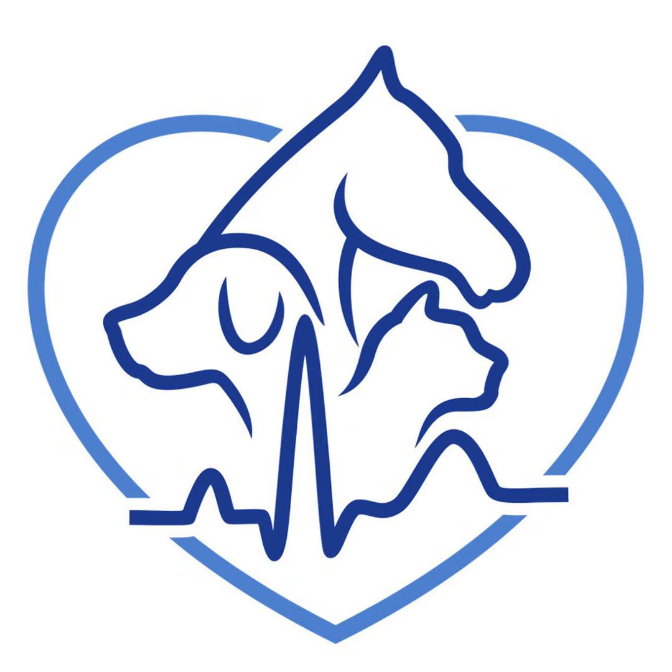I see the 2D image so well with traditional imaging, and the bubbles come in, they opacify, they allow me to make my measurement. And yes, the bubbles are being destroyed very rapidly, but it's allowing me to do what I'm trying to assess clinically. I don't really need the bubbles to be there for 4 minutes. That's not what I'm looking for. I only need them to come in, do their job, and then they can be gone in a minute.